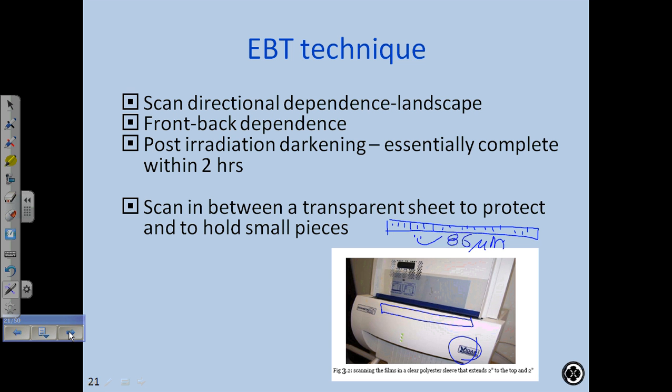There was one difference. There was some silver tape wrapped around one end, and I think that silver tape was there so the light doesn't shine around the side, around behind, and doesn't create any scatter light. So he bought some silver tape and put it on there. We plugged it in, and it was fine. So we fixed our VIDAR scanner. We saved $2,000 by getting a $6 tube. So anyway, that's how it works.